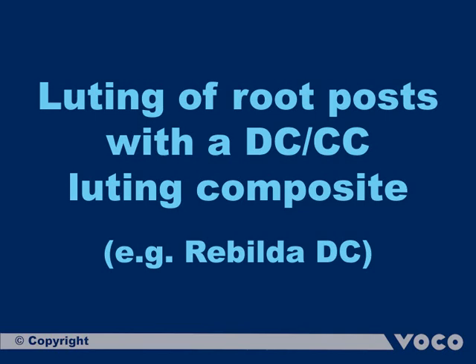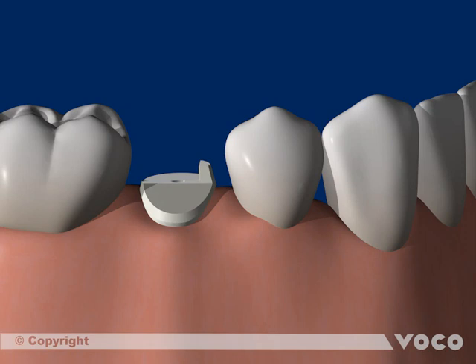Luting of root posts with dual curing or self curing composites. The following sequence demonstrates how a root post is fixed with a dual curing luting composite.